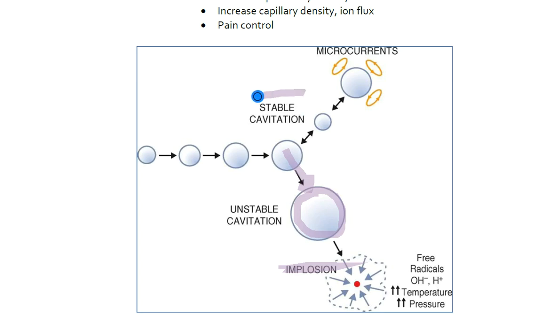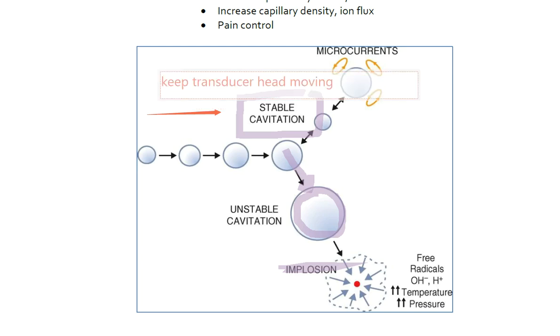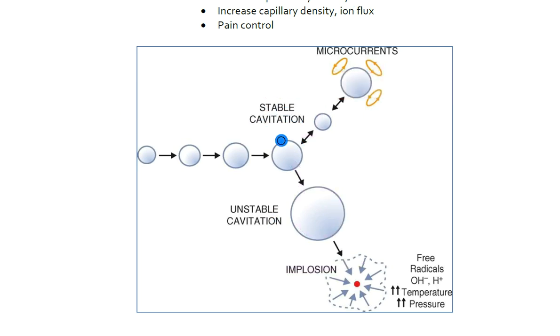The reason I mention this is to avoid the unstable cavitations, and how to get the stable cavitations is quite simple. If you move the transducer head and continue to move the transducer head, you will avoid the unstable cavitations and you'll stay with the stable cavitations.